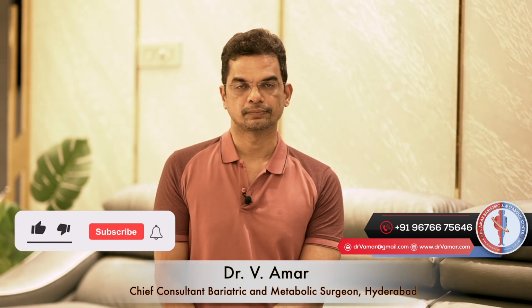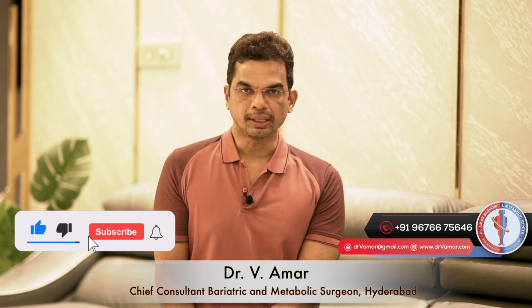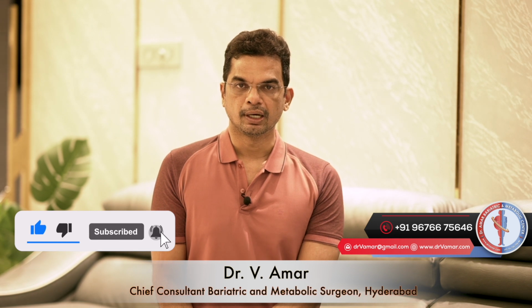Most commonly kept balloons are Orbera intragastric balloon, which has been FDA approved, and Orbera 365 balloon. While Orbera balloon is kept for 6 months, Orbera 365 balloon is kept for 1 year. There is another balloon called Spatz adjustable intragastric balloon which can be kept for 1 year. These are regularly used balloons. For all these balloons, we need to do endoscopy and the procedure has to be done under short general anesthesia or sedation. Even during balloon removal, we need to do upper GI endoscopy under short general anesthesia or sedation and the balloon has to be removed.